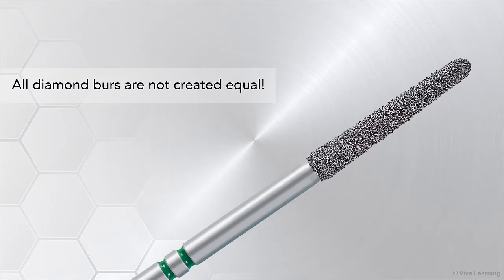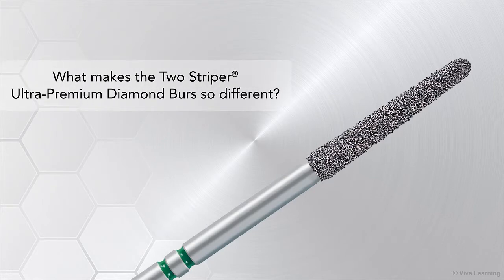As any practitioner who has tried multiple products has experienced firsthand, all diamond burrs are not created equal. What makes the Two-Striper Ultra Premium Diamond Burrs so different?